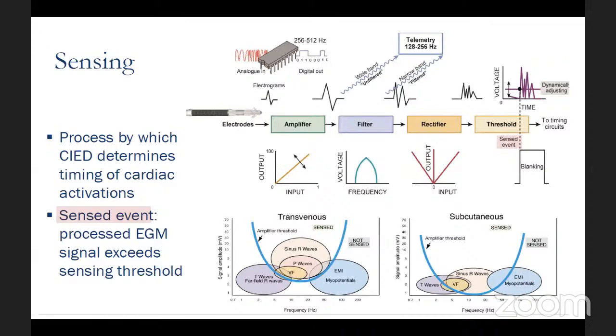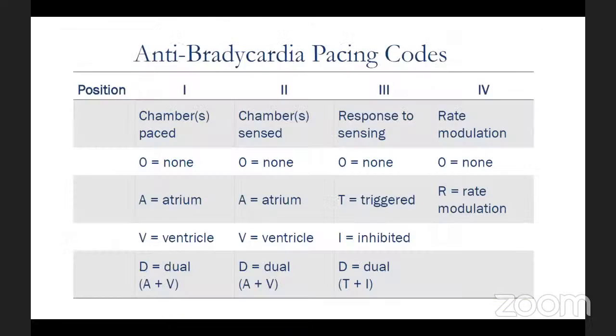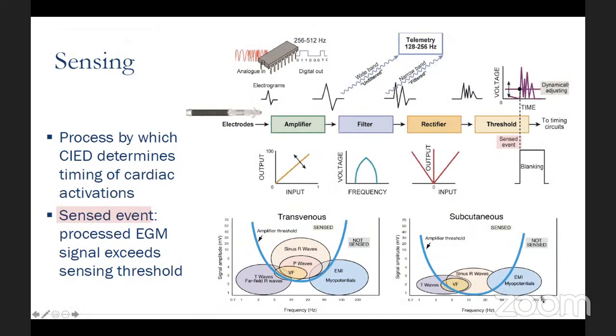Definitely. Yusuf, just a quick comment, if you don't mind, about the abandoned leads. That's really good information. We still, here in our center, use the precaution of not taking those patients to the magnet, to the MRI.